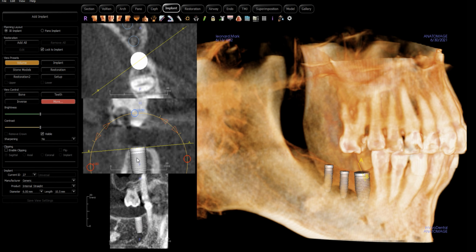So although it might be true that this beefier implant might be more structurally sound, lots of studies have shown that 4mm implants, 4 to 4.5, are just as strong as an implant of this size. We could get into the whole discussion about size of implants. I really don't want to waste any time on this video for that. Suffice it to say, wider isn't always better when it comes to treatment planning.